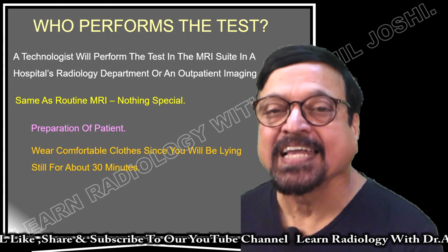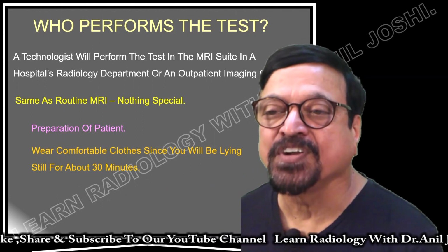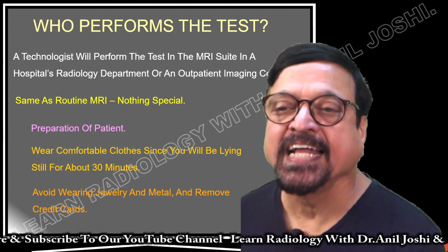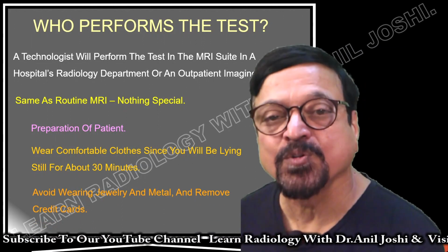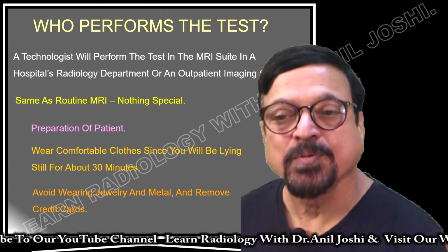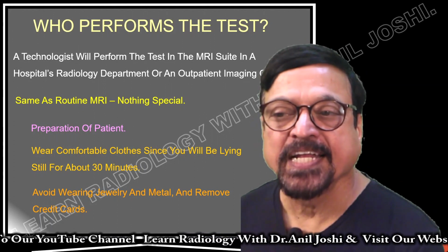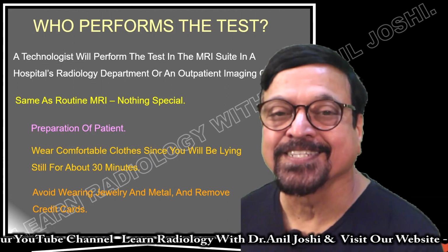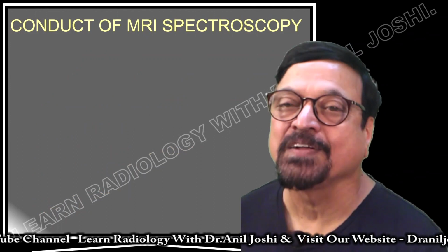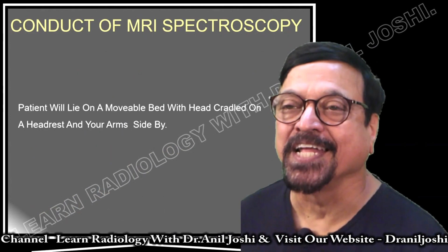Then again we ask the patient to wear either comfortable clothes or we give gowns from our department, and he has to come at least 30 minutes before the procedure so that he will be comfortable. Then what should be avoided? Jewelries, metals and credit cards.